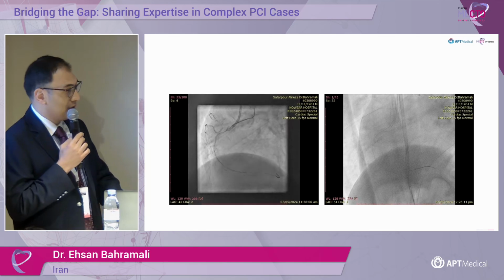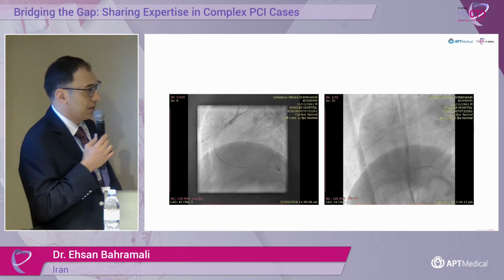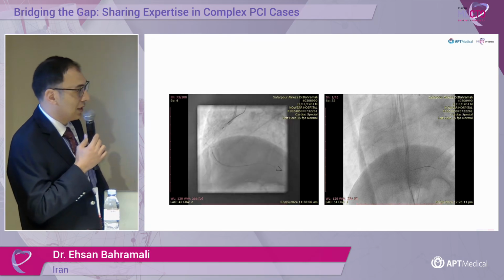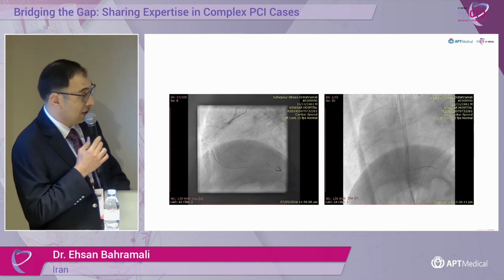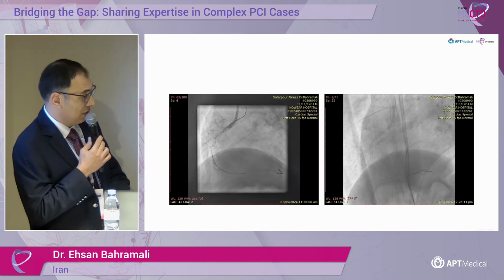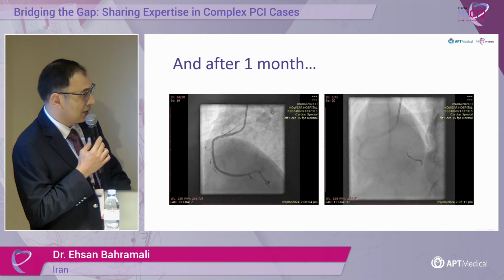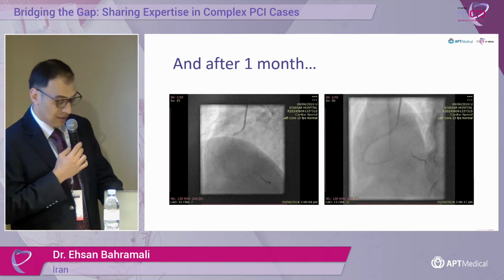And the reason I'm sharing it is that the ELONG microcatheter passes pretty easily without this support, but every balloon we tried to pass with this support, we couldn't pass. We were obliged to exchange for a 7 French guiding catheter and do the anchoring balloon technique to be able to pass it. And this is the final result, as you can see. And it was a diseased distal RCA.